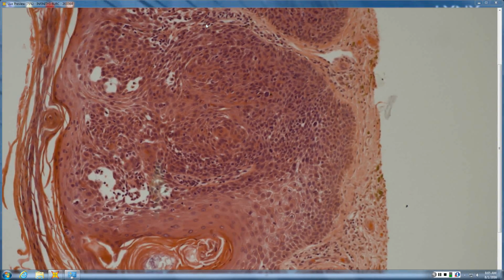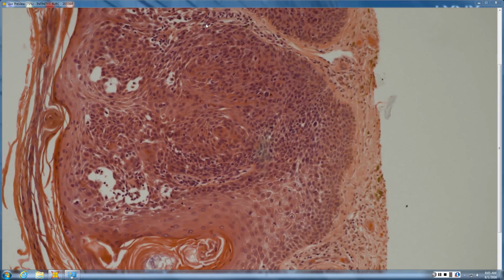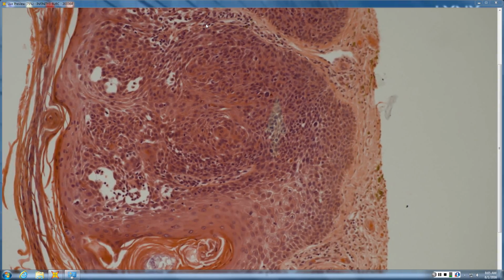In the squamous world, number of mitoses does not help you between malignant or benign. Pleomorphism does not help you between malignant and benign. The single best discriminator is the nuclear envelope. If your nuclear envelope is thick, refractile, glassy, notched, corrugated, that's cytologically a malignant squamous cell.